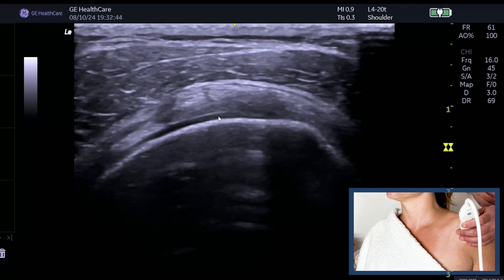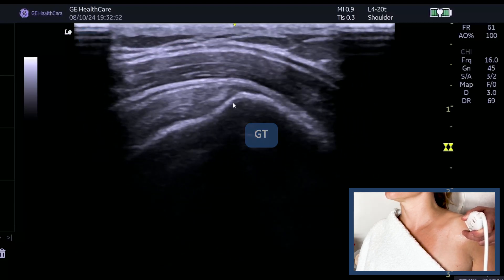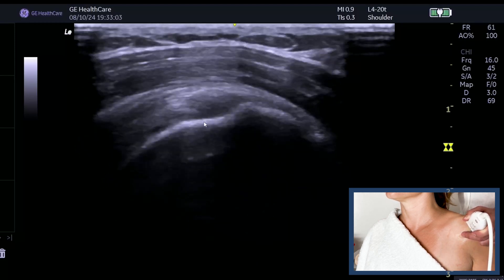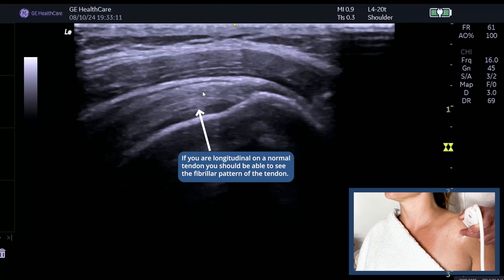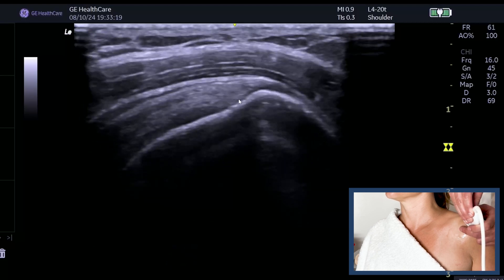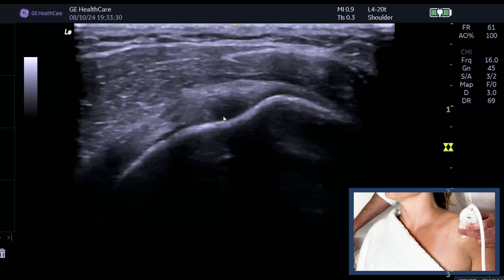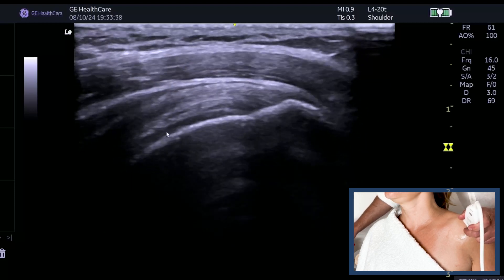Here are a couple of tips in long. This is supraspinatus in long — this is the greater tuberosity. If I push my probe forward, you can see I'm now long on the long head of biceps, which means when I come laterally I'm going to be truly long on supraspinatus. You can see the fibers in long — if you say you're long on a normal tendon, you should see nice long fibers attaching in. Watch this: if I'm not truly long and I rotate, look at these dark patches that appear. Is that an articular-sided tear? It's not — it's because you're oblique on the tendon. So make sure if you say you're long, you're long. Make sure you've got the bone bright, you can see that parallel band of cartilage, and as you push forward you're on a nice long section of biceps.